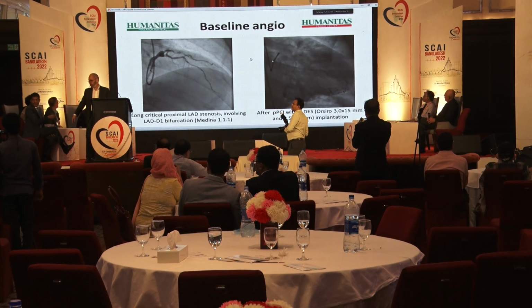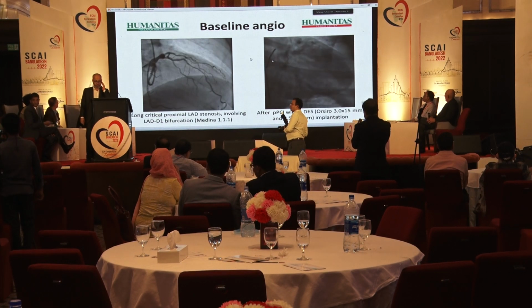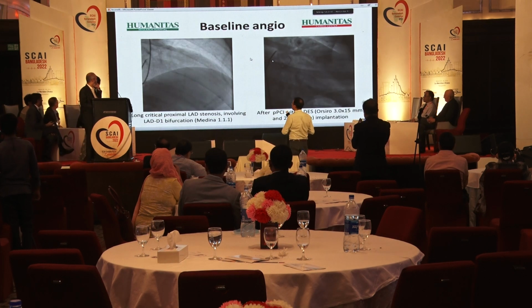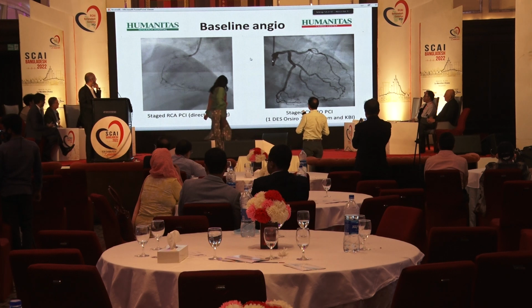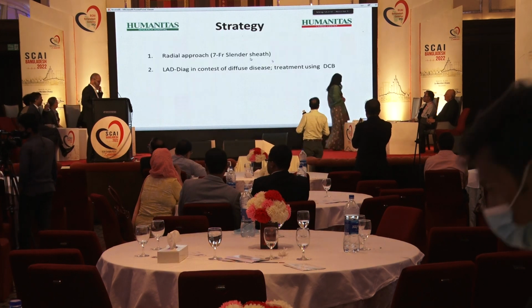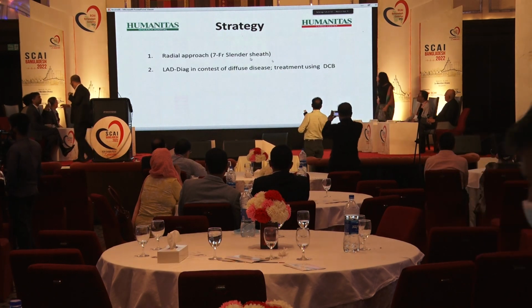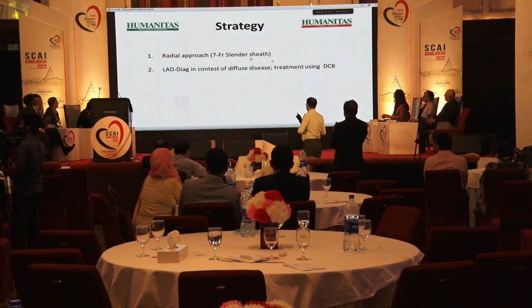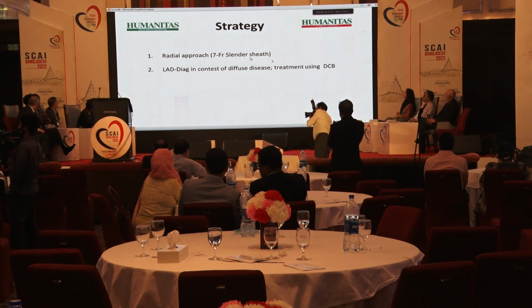And in the next slide, we can see what will be our strategy. So let us show what we did so far. We are working through a 7 French radial access with a 7 French guiding catheter on the left main.